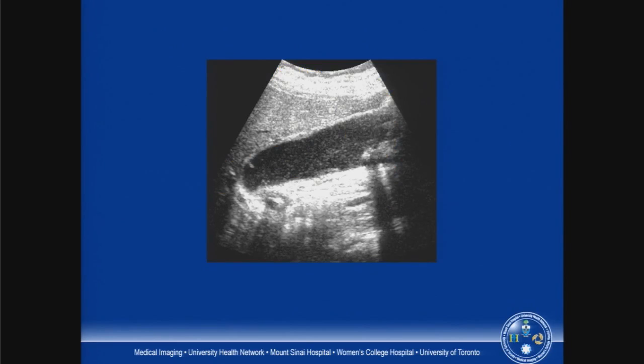So here's our patient, a woman in her late 30s with right upper quadrant pain for approximately 22 hours. We can see immediately that there are gallstones and there was maximal tenderness over the sonographically localized gallbladder. So in that context, a positive predictive value of greater than 90% for acute cholecystitis. Note also that this gallbladder is tensely distended. Note that the wall is not thickened and we don't see pericholecystic fluid. So that shouldn't put you off the diagnosis.